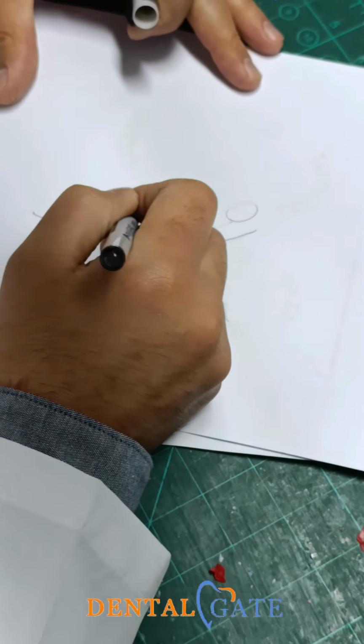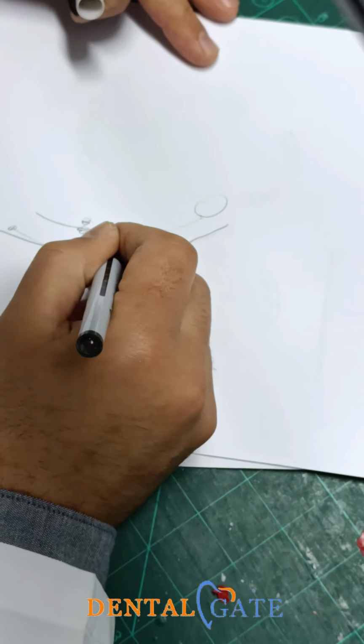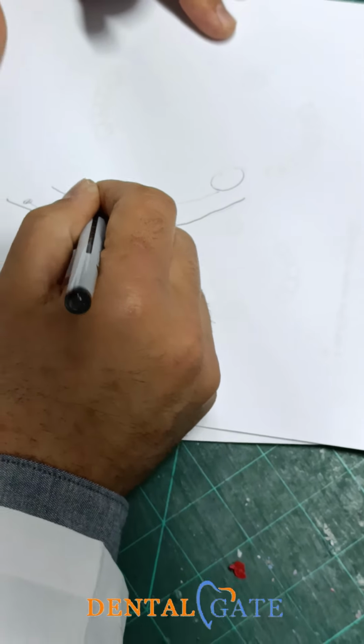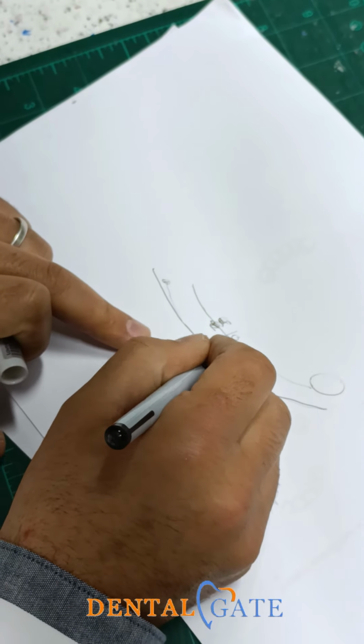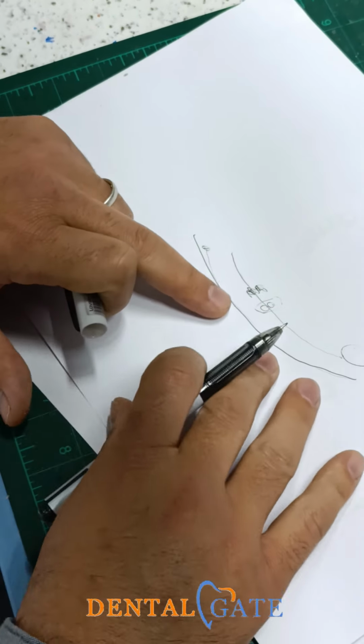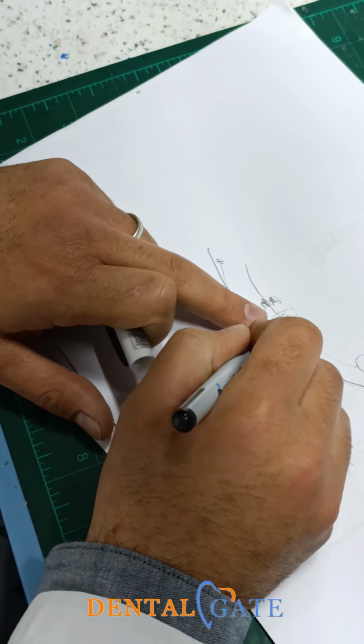So you can see the second premolar. Sorry, I will put it here. The second premolar will represent the horizontal one without any curve.